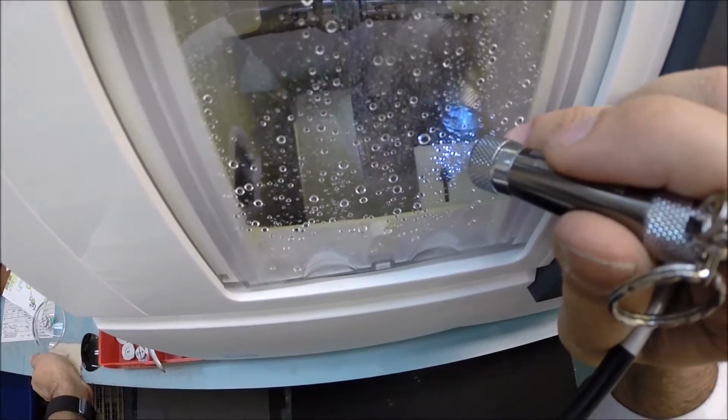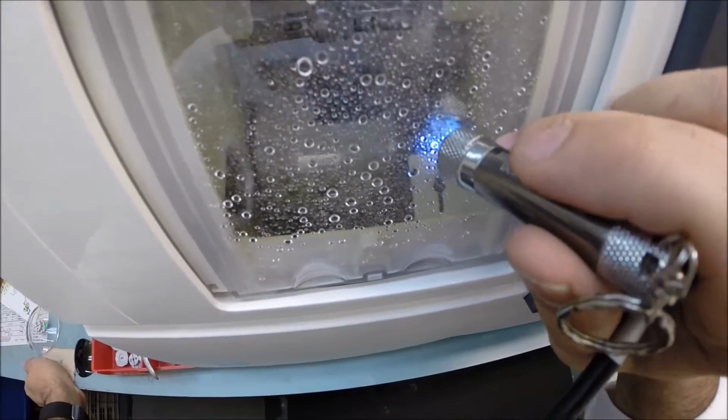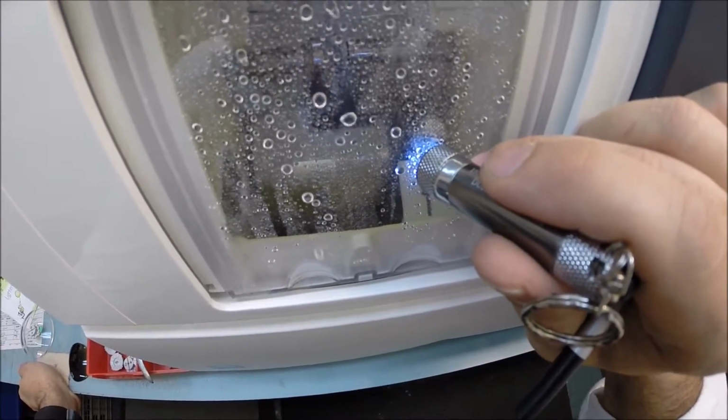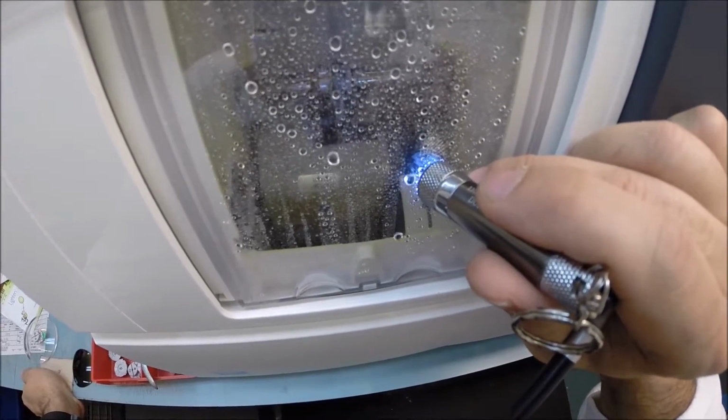Now this arm is moving into place and you will see a little round wheel on the end, something you would find on a Dremel tool. That's what's putting the safety bevel on the front surface of the lens and then the back surface. That's just to smooth out any rough edges that may be left over from the cutting cycle.